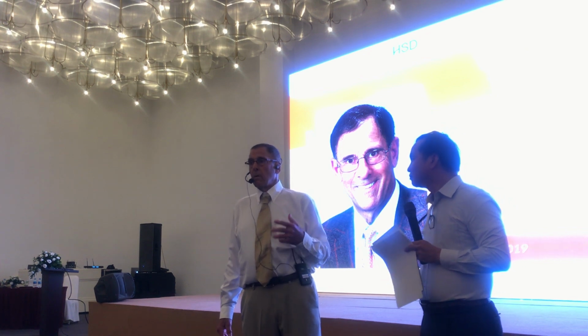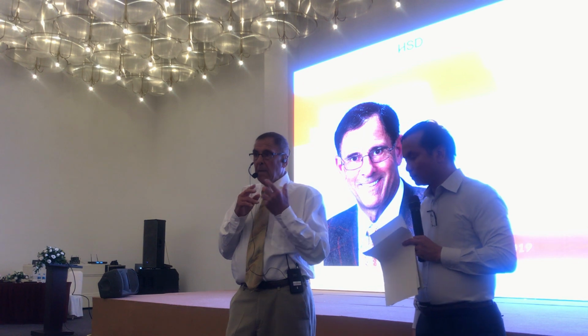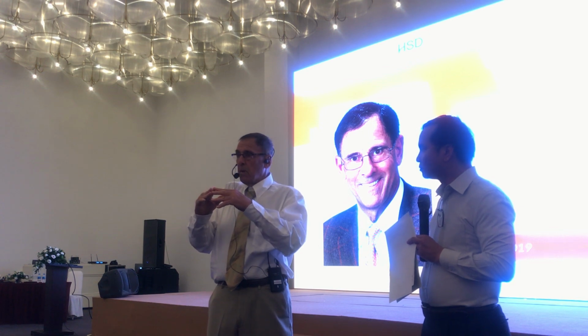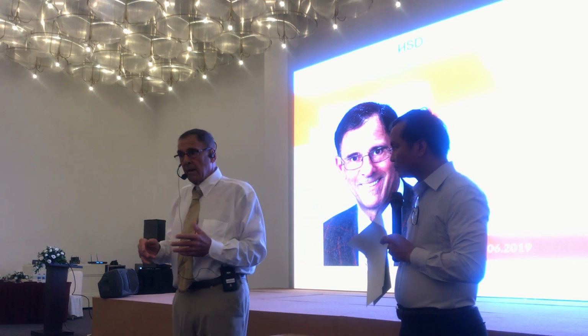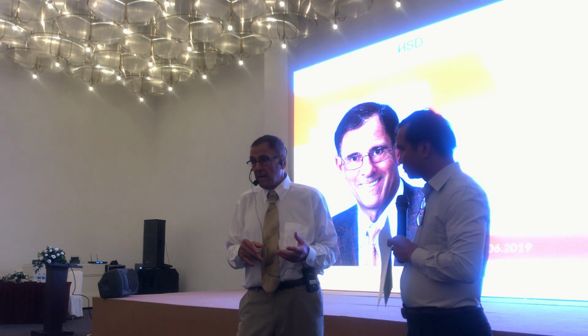When you do any change in the shape of the ridge, it needs covering with soft tissue. The sinus graft, you open and you close exactly the way you found it. No periosteal release, no moving tissue around. For ridge augmentation, you have to cover it, and you have to cover it without tension.